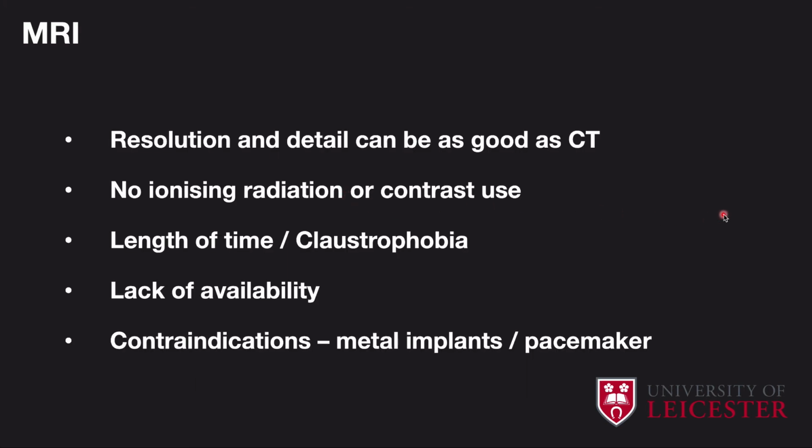So MRI can produce resolution and detail as good as CT scans, but it's not always available. It takes longer, and there are some major contraindications for its use. It is therefore more suited to elective cases.